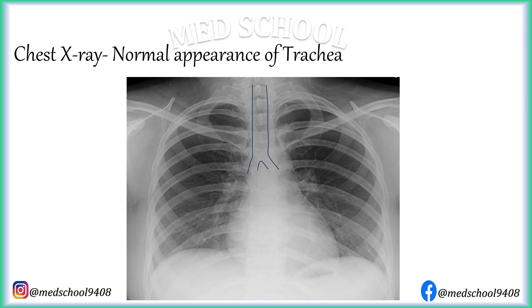Normally, trachea divides into left and right bronchus at the level of the 4th thoracic vertebra. This point is called the carina. The first thoracic vertebra can be identified as the vertebra to which the posterior end of the first rib is attached, and the 4th thoracic vertebra can be counted downwards from it. Right bronchus is more in line with the trachea and is wider than the left bronchus, making the right lung vulnerable for aspiration. Left bronchus is at an angle to the trachea. The angle between right and left bronchus is called the carina angle, normally 40 to 80 degrees. This angle is widened in cases of left atrial enlargement, subcarinal lymphadenopathy, or mass lesion.